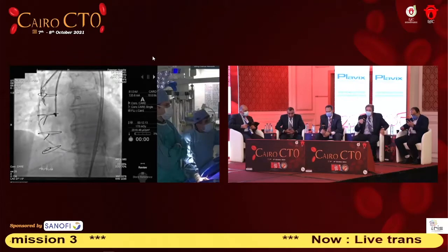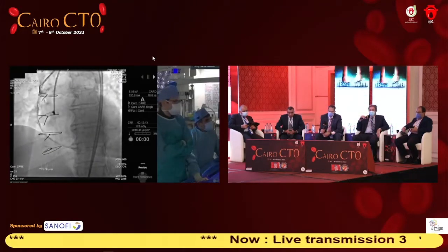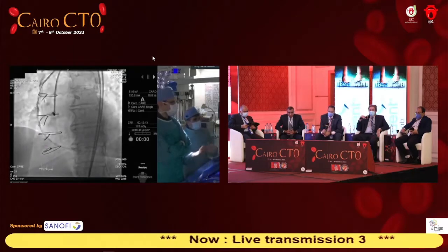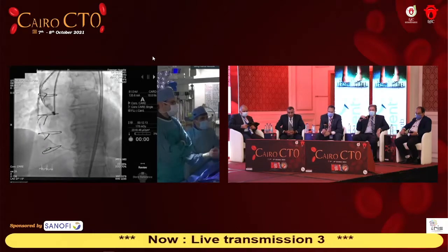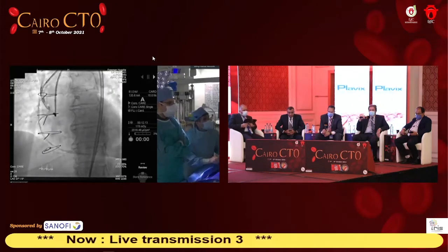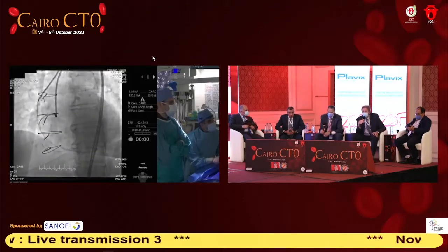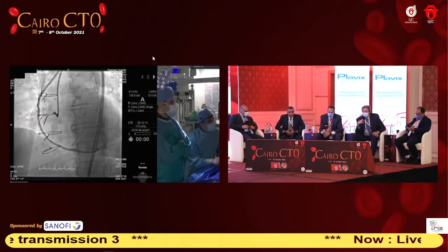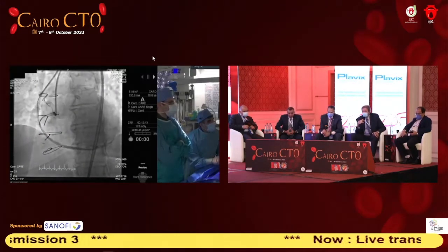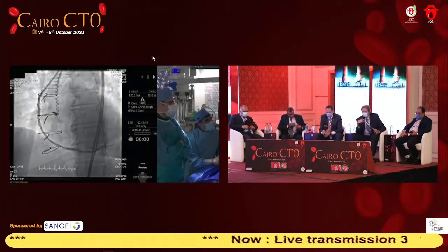So we went retrograde. You could see the Corsair XS, Corsair Pro XS. And the Corsair Pro XS is smaller than the Corsair Pro, but bigger than the Caravelle. So it gives you kind of the best of both worlds. Okay. In retrograde, you usually use certain wires. But does it differ if it's from the vein graft? You use different wires or the same choices of Sion and so on?